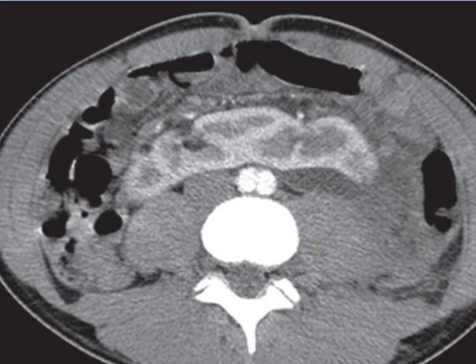And this is the lower cut level, and we see this is the thick parenchymal isthmus, and this is the aortic bifurcation, and this is the inferior mesenteric artery, and this is the large amount of fluid in the perirenal space.